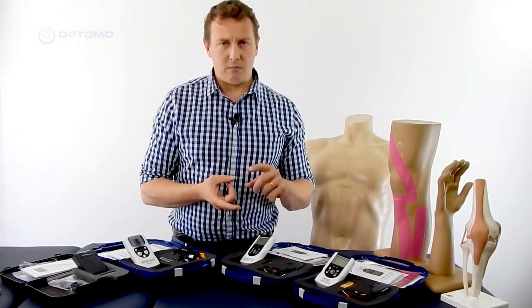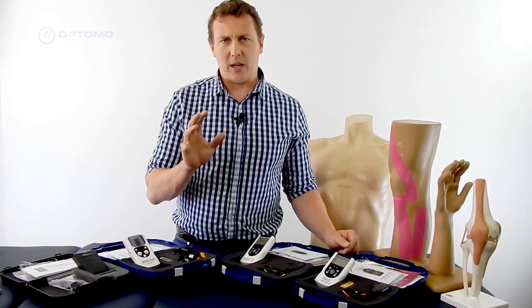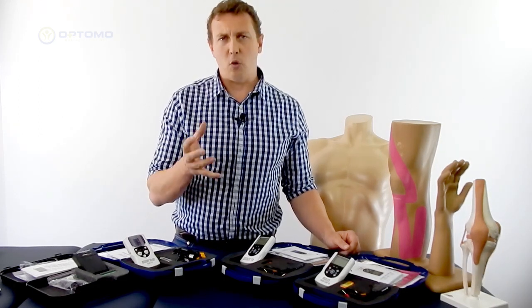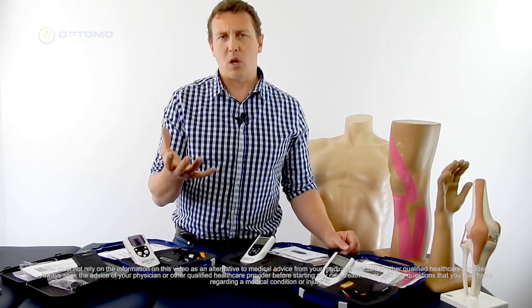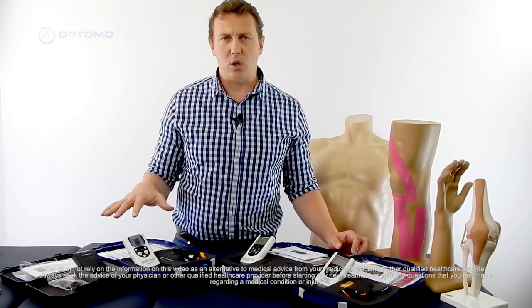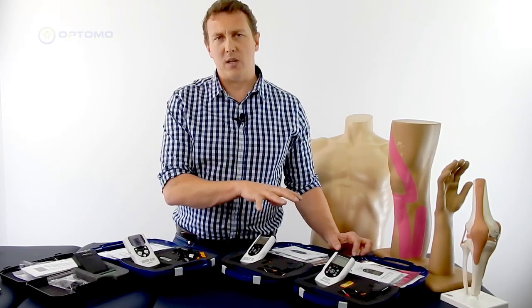The muscle stim is for muscle stimulation. When you've got muscle atrophy or your muscles are wasting away due to disuse — because you might be injured and immobile — the muscle stim works by sending similar electrical currents into the muscles with a slightly different waveform, which triggers a muscle contraction. The muscle stim contracts and relaxes the muscles, passively working them when you can't actively work them yourself. So while they look very similar, they are used for completely two different things: TENS for pain relief, and muscle stim units for stimulating muscle and increasing muscle use.